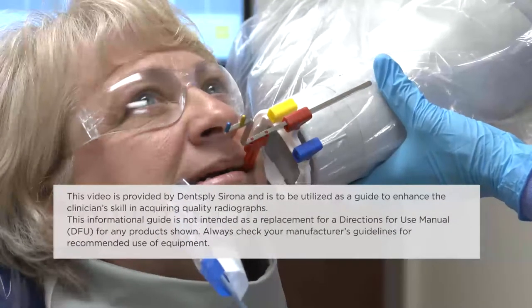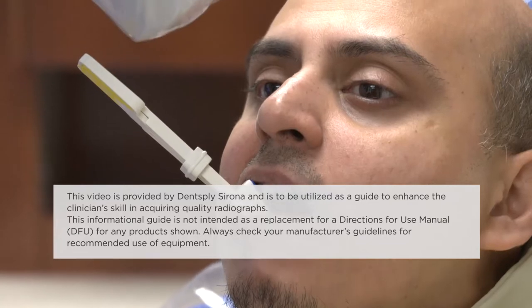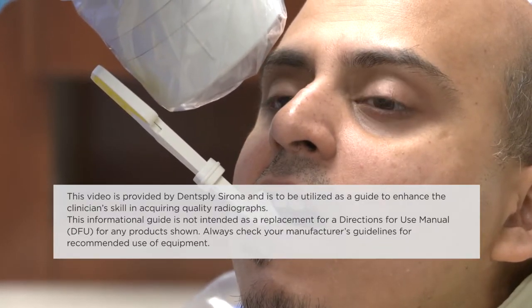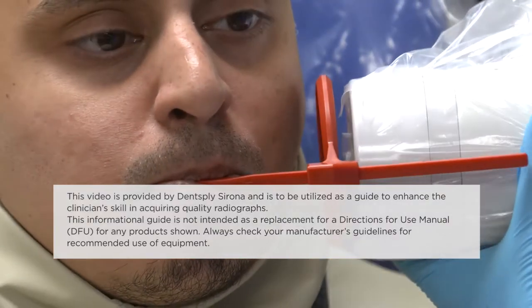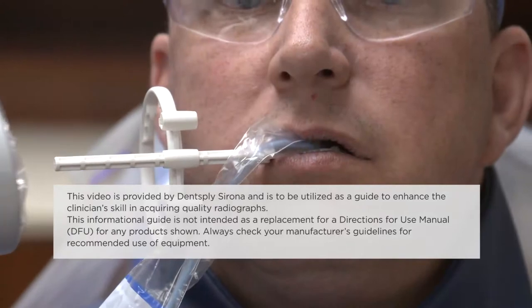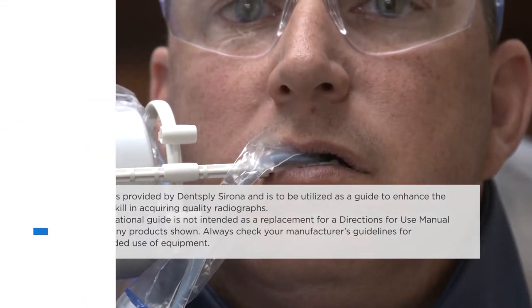This video is provided by Dentsupply Sirona and is to be used as a guide to enhance the clinician's skill in acquiring quality radiographs. This informational guide is not intended as a replacement for the directions for use manual for any products shown. Always check your manufacturer's guidelines for recommended use of equipment.